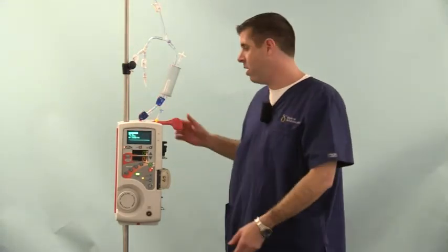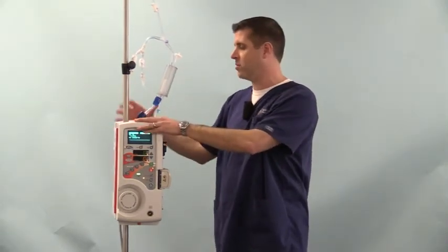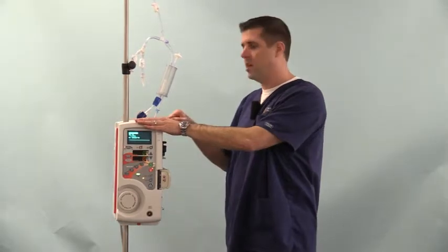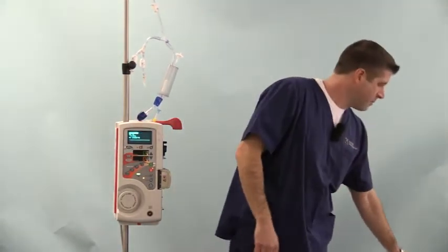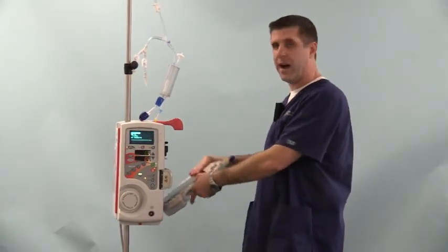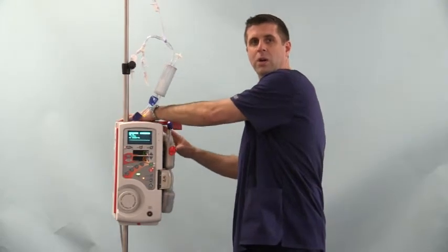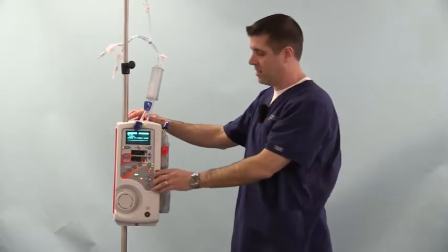Now the unit is powered on, and I've placed the load latch in the load position. That's facing the operator directly out. So I want to move it from the closed position directly toward the operator. Now we're ready to set up and go. I'll take the one-piece disposable cassette, place it at a 45-degree or greater angle onto the unit, and close the load latch. Now the cassette is secured.